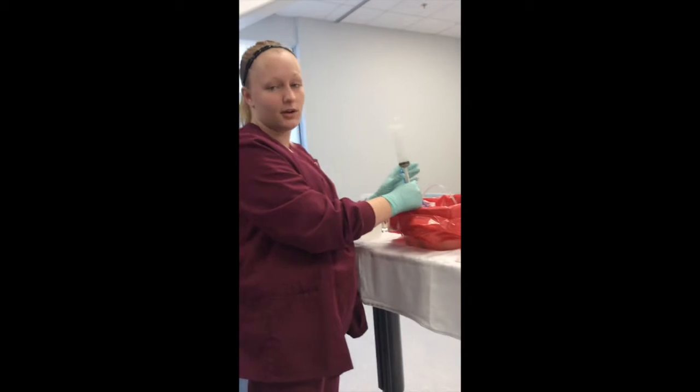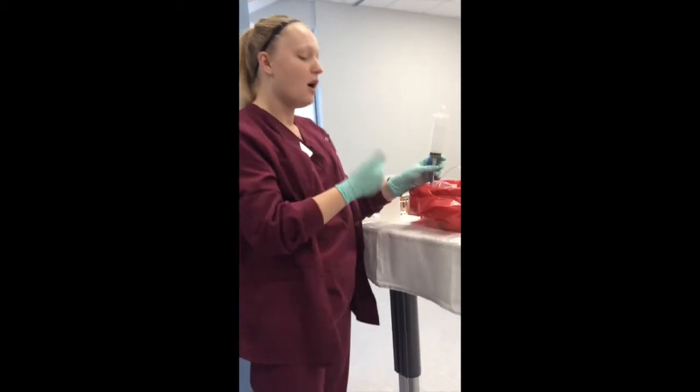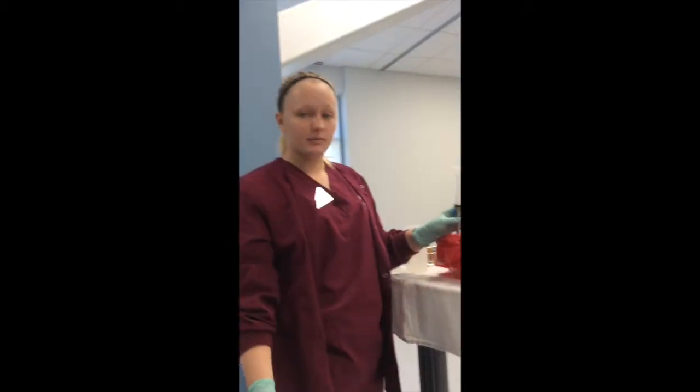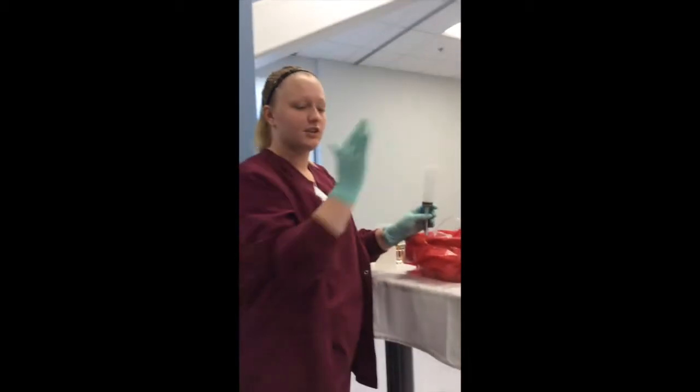If it is more than 200 milliliters, I'm going to return the 200 milliliters, and I'm going to waste the other. If it's over 500 milliliters, that's something I'm going to have to report to the doctor. So if it's under 200 milliliters, I can just return it all.